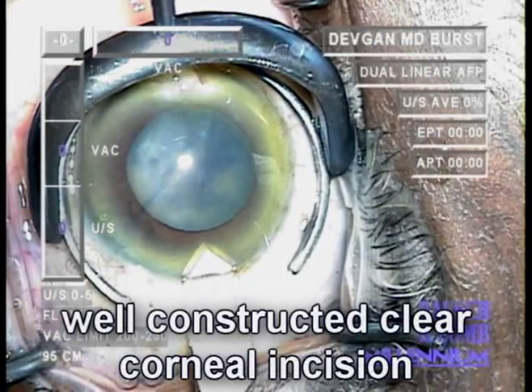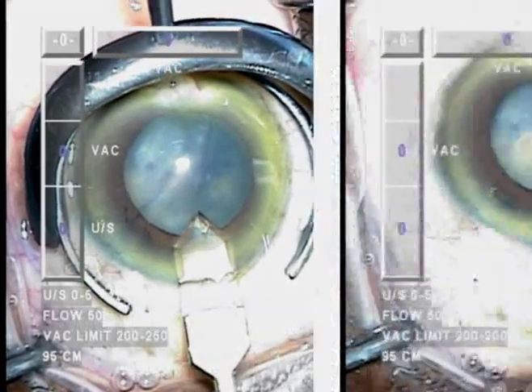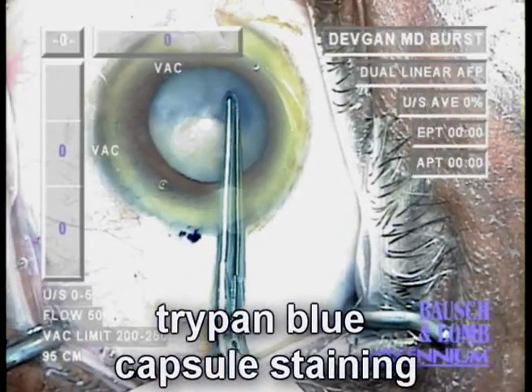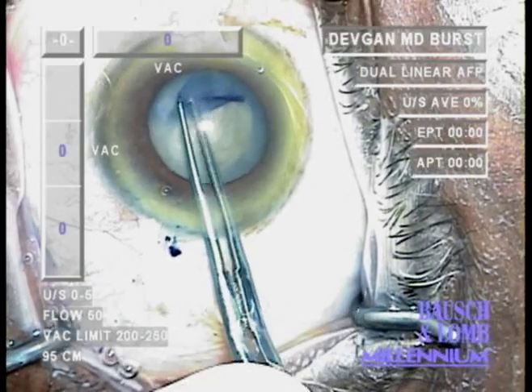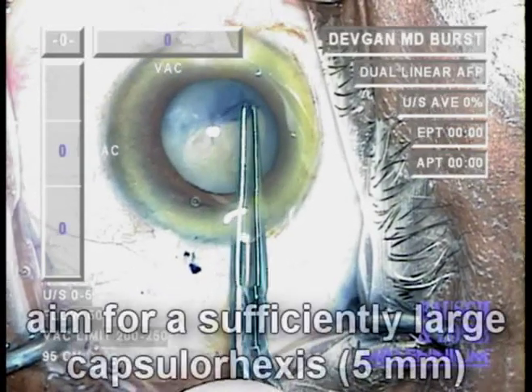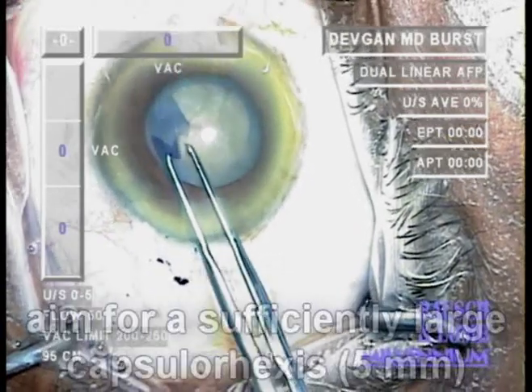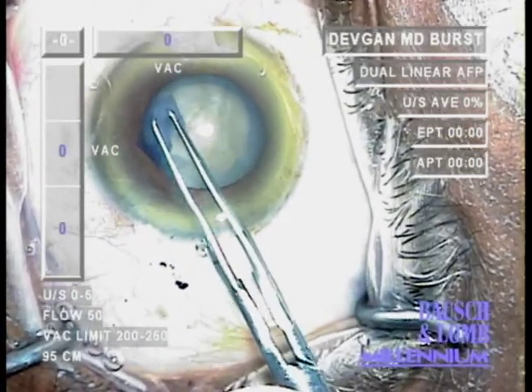I want to show you that the clear corneal incision is very well constructed. We'll go ahead and use TriPan Blue to stain the anterior capsule and perform a capsulorrhexis. We're aiming for a sufficiently large capsulorrhexis of about 5 millimeters. This is not so simple because the eye is very small.